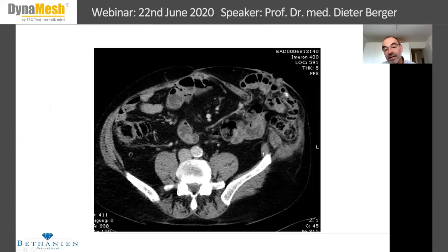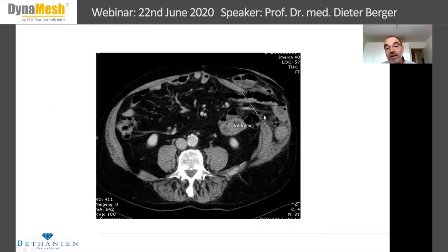The lateralization of the stoma, which fortunately was achieved right here. In this part, with some difficult adhesiolysis, you can really lateralize the stoma loop for 5 to 6 centimeters. But this is really limited. The lateralization is limited in this case of lateral stoma.